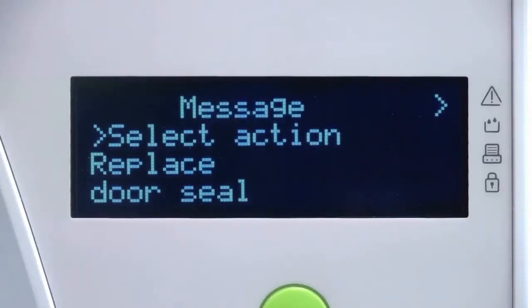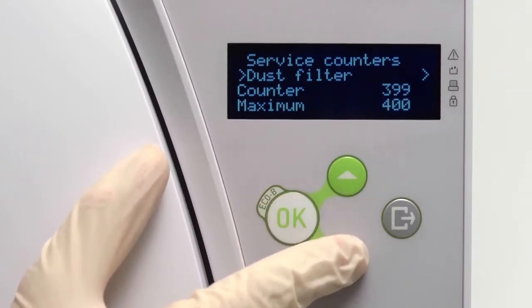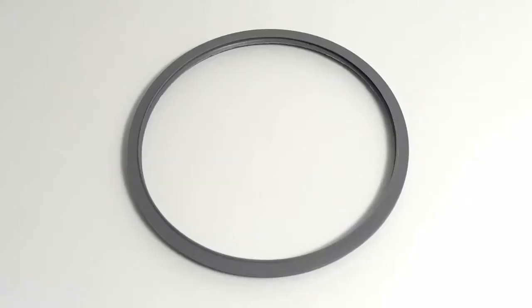Your Lina steriliser will automatically prompt you when the life of the door seal has expired and needs to be replaced. Alternatively, you may view the number of cycles completed by the door seal from within the service counters screen of the menu. There are no special tools required to complete a door seal change. This can be carried out by the operator.